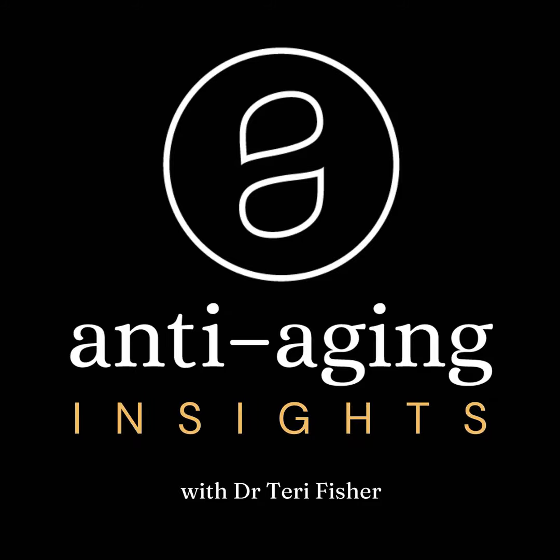So the key is to match the syringe to the product and to the treatment area. And using a 1 milliliter syringe, for example, for dermal filler is a great size syringe because oftentimes we are injecting half or 1 milliliter of filler at a time, and these syringes are made perfectly for that.